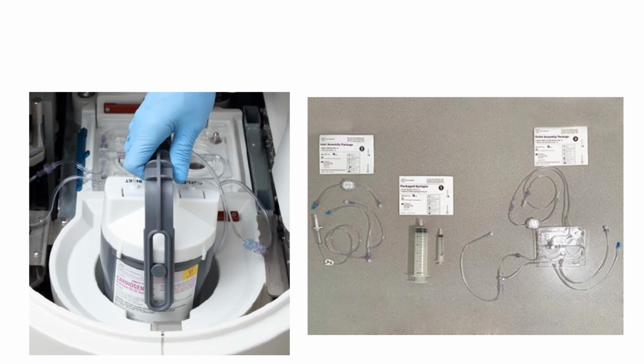So this is an example showing the Cardiogen generator being installed and changed out. There's a lot of different tubing and that needs to be put in the right places. This first one here, assembly package, is where it hooks to the saline. And then it has syringes here that go inside of it. And then it has the patient admin kit where it actually will put the dose to the patient. So that patient admin set is what's hooked up to the patient.